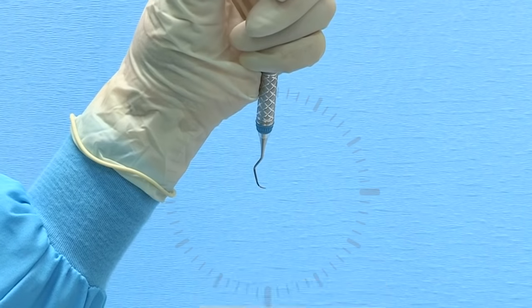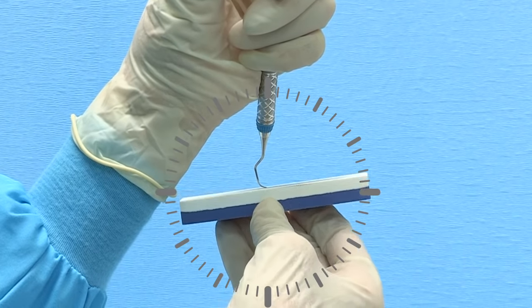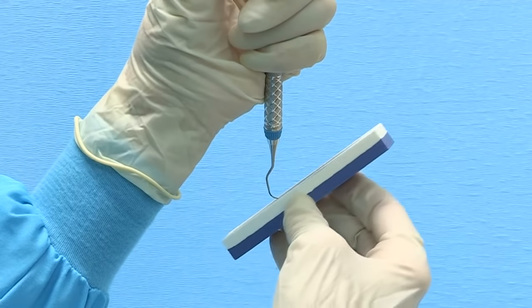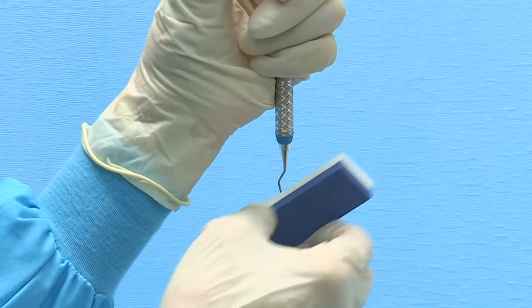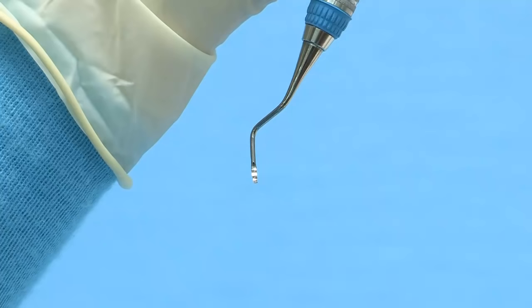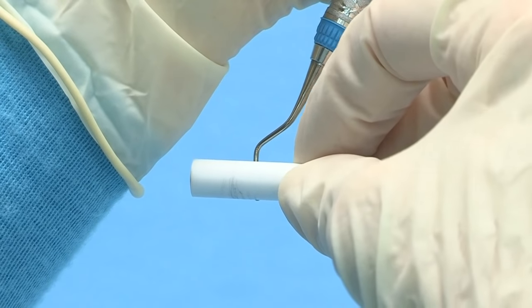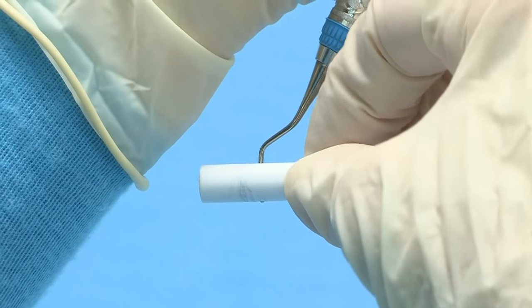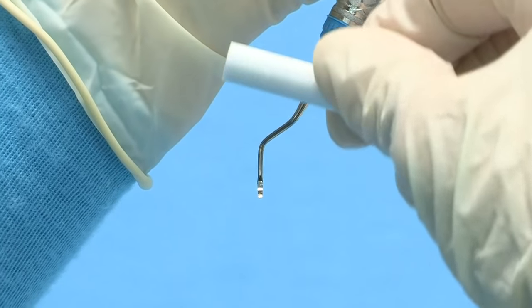To maintain the rounded shape of the curette toe, rotate the instrument handle so that the toe is pointed at 3 o'clock. Position the stone underneath the blade at 3 o'clock and tilt upward toward the 2 o'clock position. Move the stone in a consistent up and down motion, overlapping strokes and rotating around the toe to maintain the rounded shape. To finish sharpening a universal curette, hold the blade at eye level with the terminal shank at 12 o'clock and toe pointed toward you. Position the cylindrical stone along the face of the instrument at 3 and 9 o'clock, then with slight downward pressure, roll the stone along the face from heel to toe to remove any wire edges.